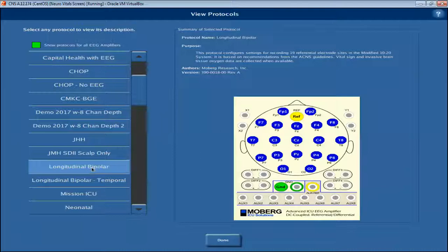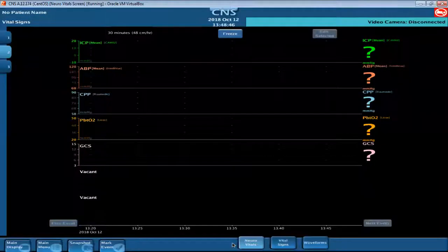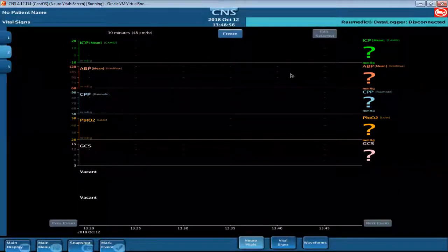I liked the thing that you taught me that I didn't know how to do before, which was to edit the labels on the right-hand side of the screen. I always just teach people to touch in the middle. I always say, oh yeah, don't bother with that. I didn't realize that there was so much flexibility on that right side. Yeah, because particularly with blood pressure, you want to see your diastolic. Yes. You don't necessarily want to just look at the mean. So being able to do that.